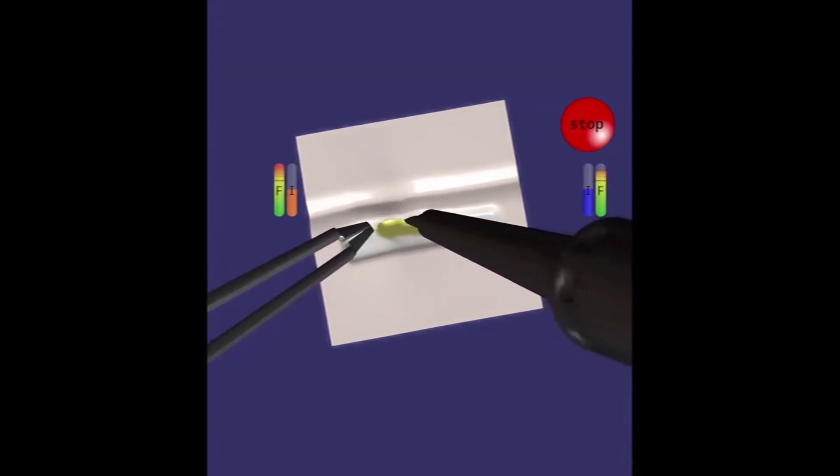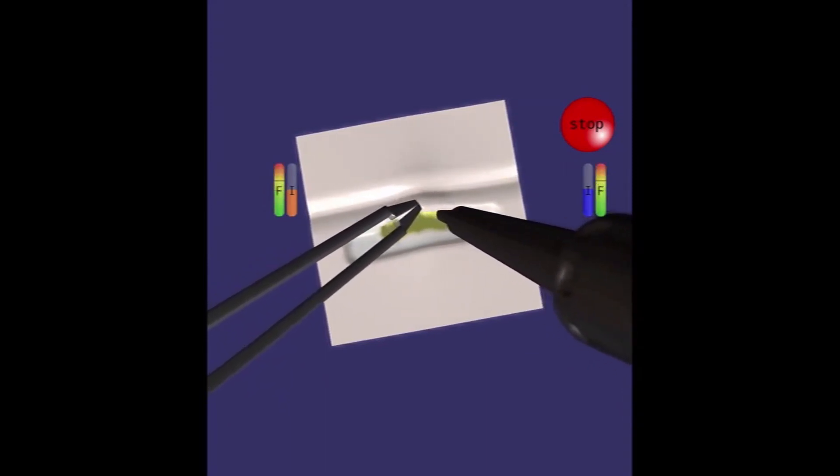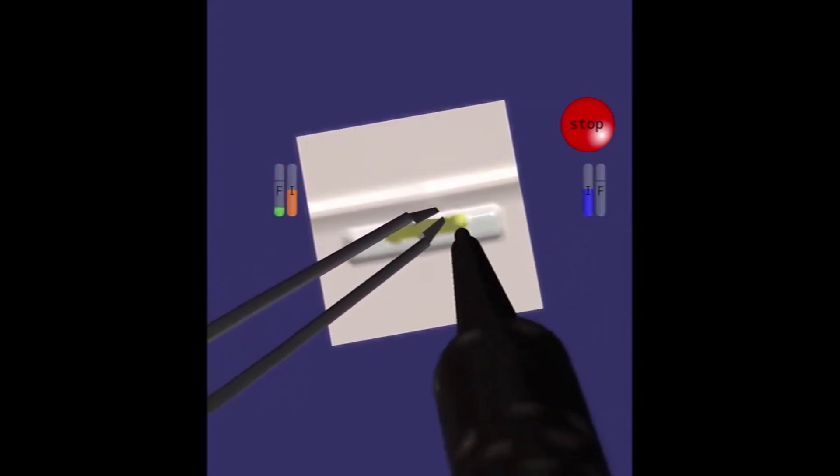After removing the superficial layer of tumor, the participant begins to use the bipolar to gently grasp the pia and expose the deeper parts of the lesion.